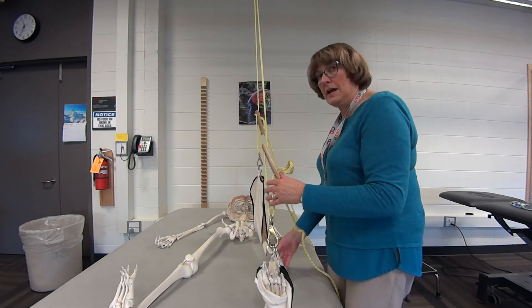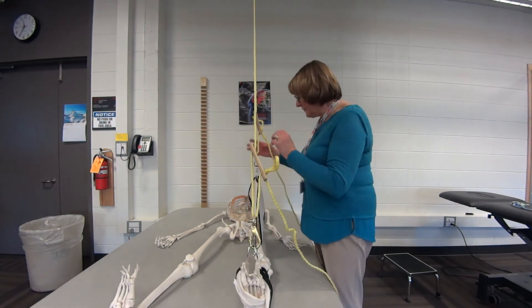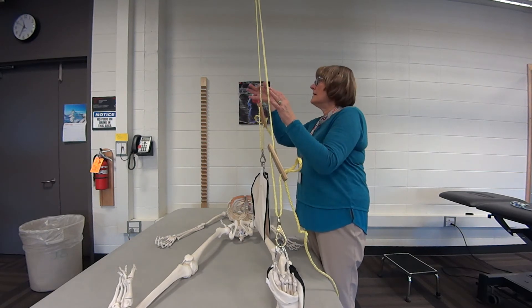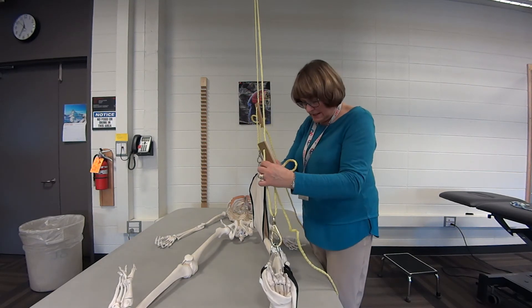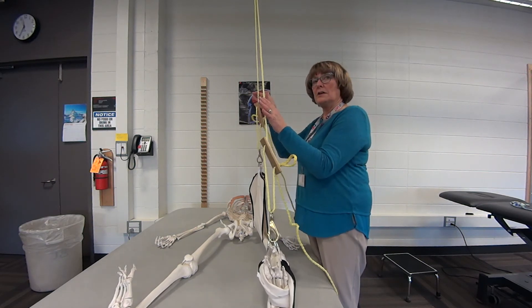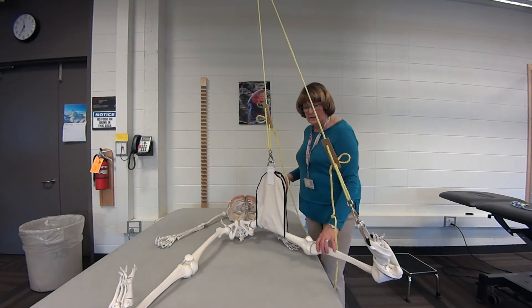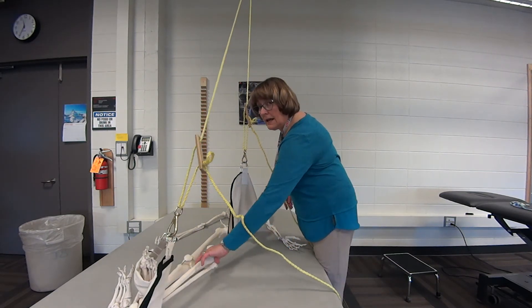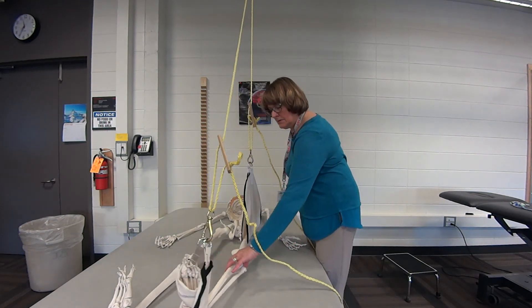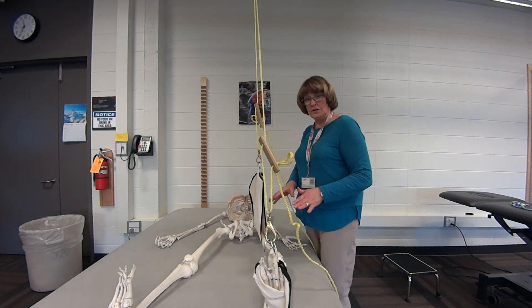Part of what you don't want to do is hyperextend the knee or hurt their knee. Make sure you have the same amount of tension on both slings — if one has more tension than the other, ease it up. With equal tension, they'll be able to easily abduct and adduct. Just want them far enough off the mat so they're not dragging.